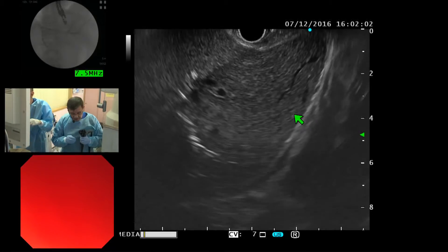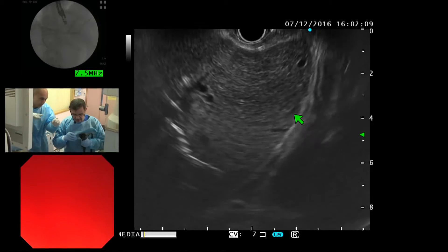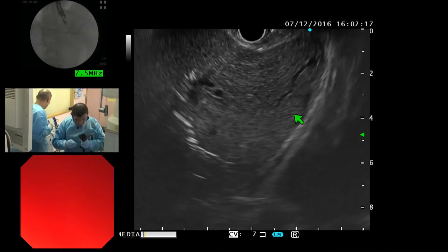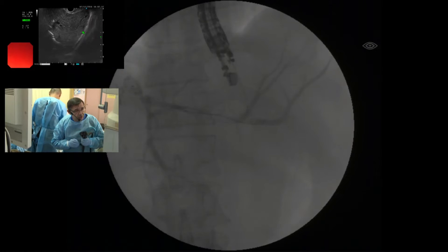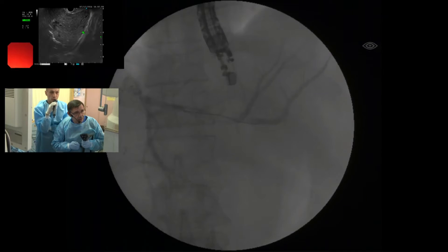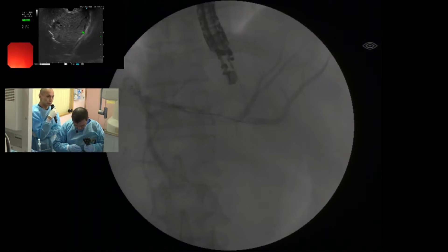After with the cystotome we can place the wire in a better position — it's not so bad. Slowly, slowly, slowly, slowly. Okay, perfect — now we go. I have a longer route to cross up to the bile duct with the cystotome. Our plan is to dilate the tract with the cystotome, and after, to pass the stent.